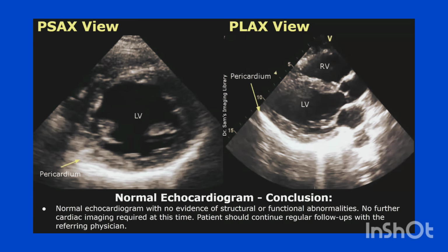You can end the report by writing the conclusion. Normal echocardiogram with no evidence of structural or functional abnormalities. No further cardiac imaging required at this time. Patient should continue regular follow-ups with the referring physician.